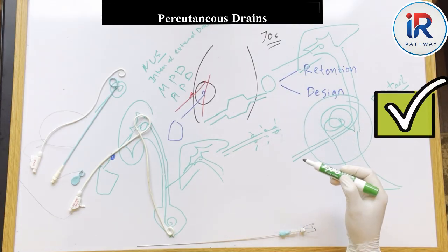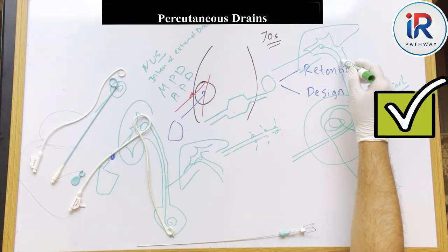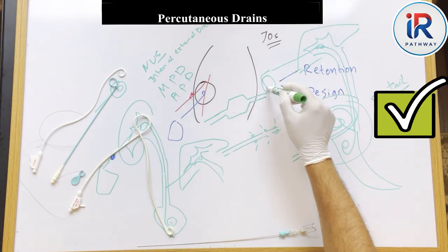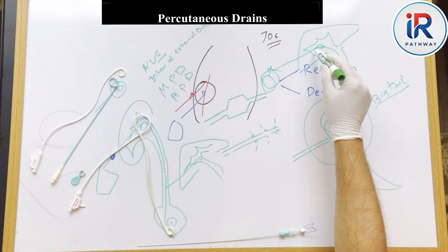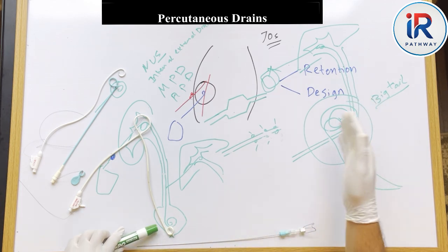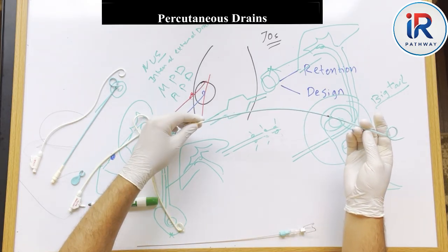Or we can use an internal external biliary drain, the same concept. It's a drain which extends into the duodenum. So if the patient opens the drain for bag drainage, the bile will drain outside. But if he caps the drain, the bile will flow through the drain until it reaches the duodenum. This is the internal external biliary drain.